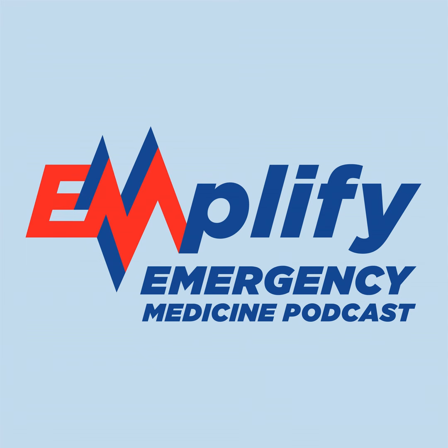And as we are setting the ventilator for our mode, we're also having to consider tidal volumes. And there is the old tried and true, how much do you think this patient weighs? Well, they look about this size. Just put them on 500, and let's just start there. Or there is a much better method utilizing an actual objective measure, and that you talked about in the article. So tell me more about that.